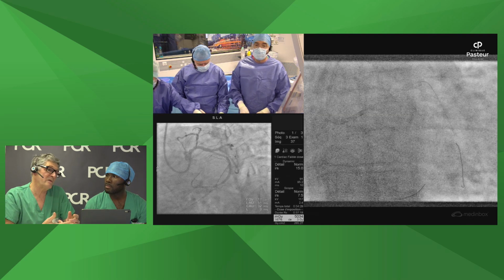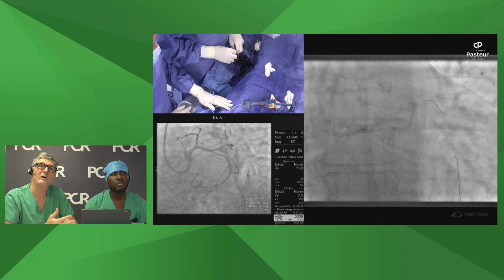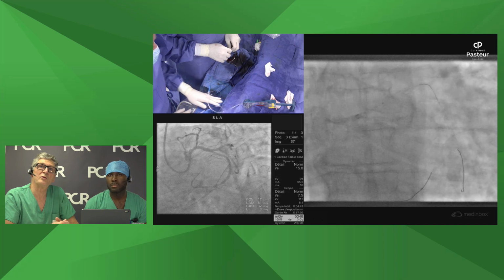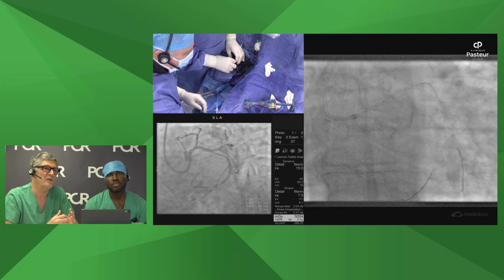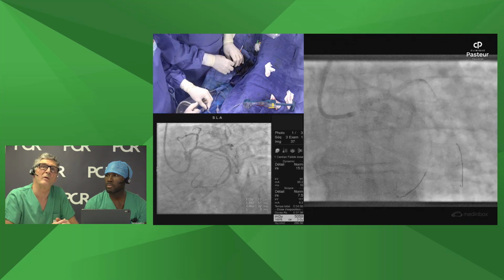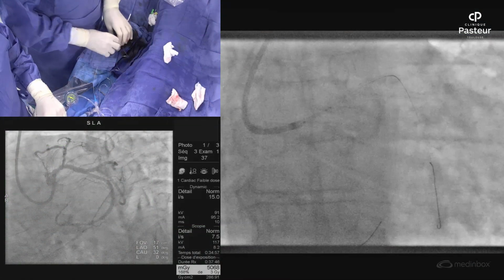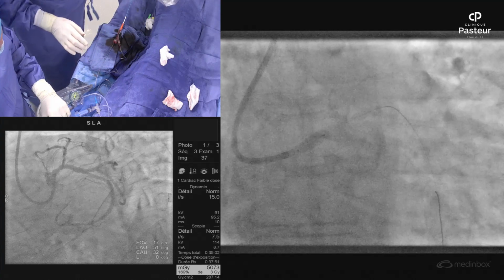It's very simple. I don't know, Jean, if you use the POT-side-POT also in some cases or in the majority of cases. I think we need more clinical data to demonstrate that this can be used for all bifurcation lesions. When the side branch is large, in my opinion, it seems not to be optimal. We don't have enough data. Sometimes we are doing the majority of the time the POT-side-POT when we have a small side branch. Okay, we are not too distant, sure.